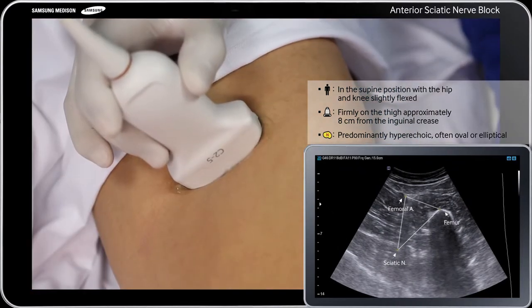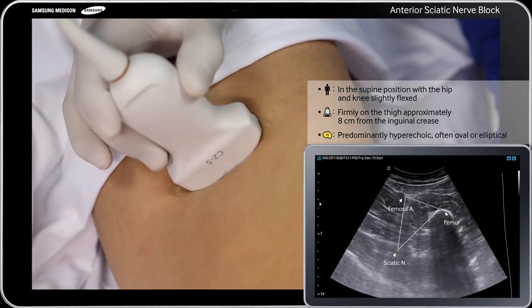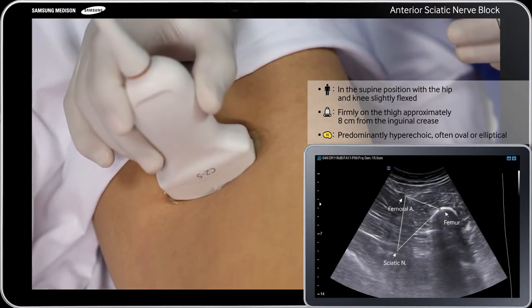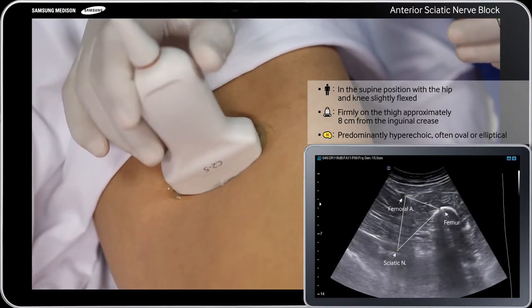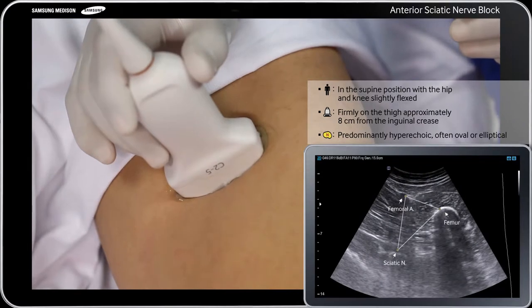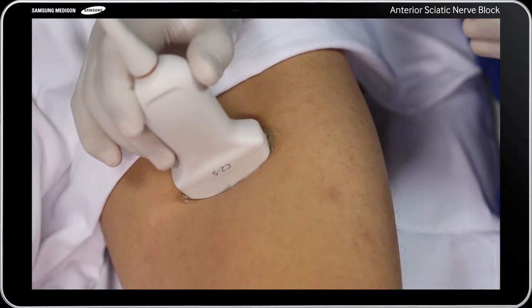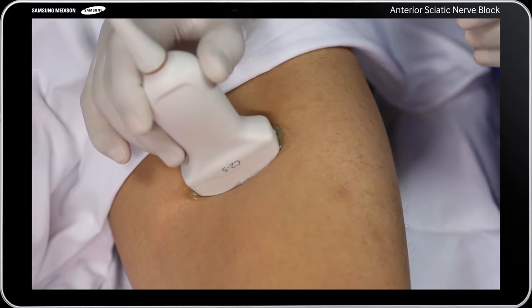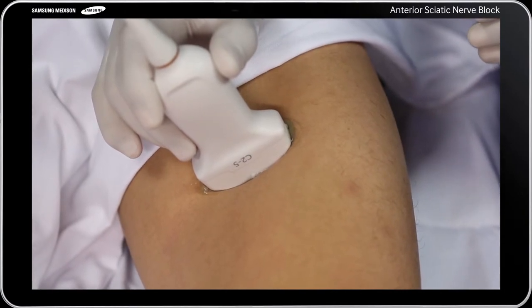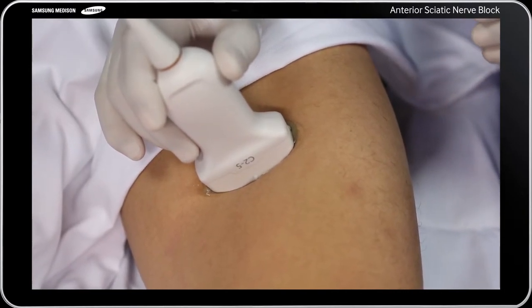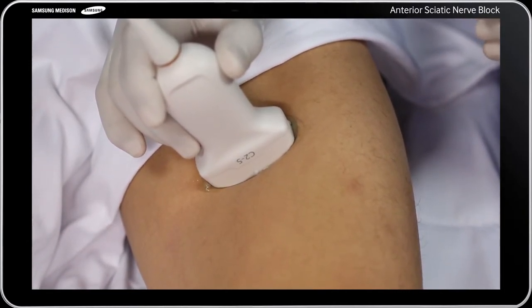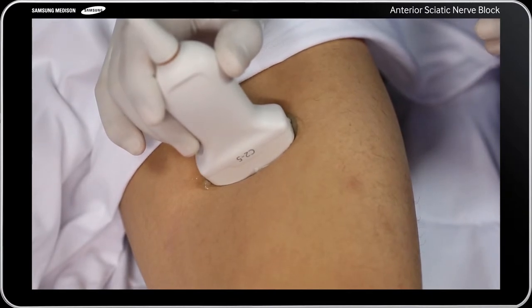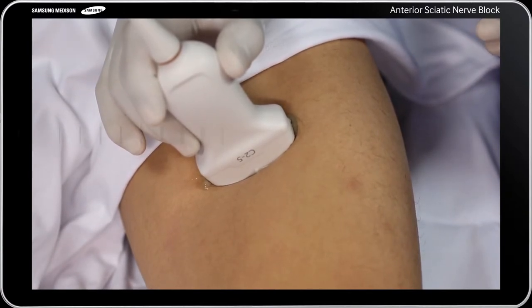Then, view the femur on the lateral side with the femoral artery at the top of the screen. Draw an imaginary line from the femoral artery to indicate where to focus for the sciatic nerve. An imaginary triangle between the femoral artery, femur, and sciatic nerve makes it easier to identify the location of the sciatic nerve.